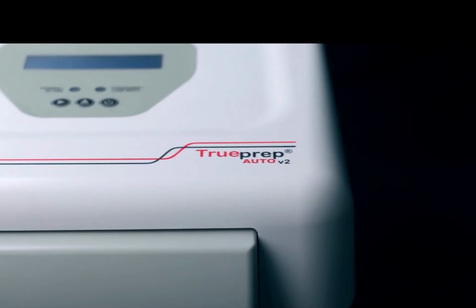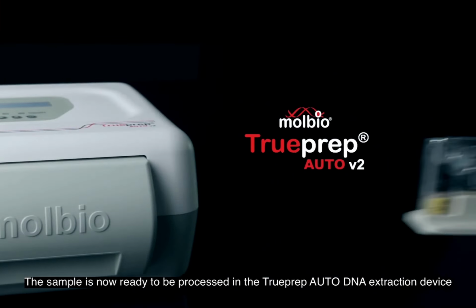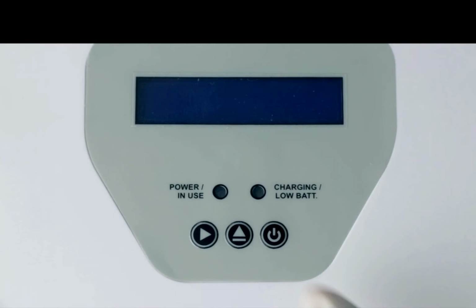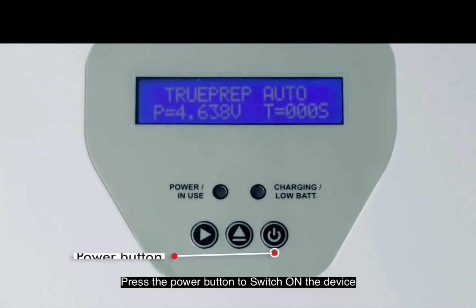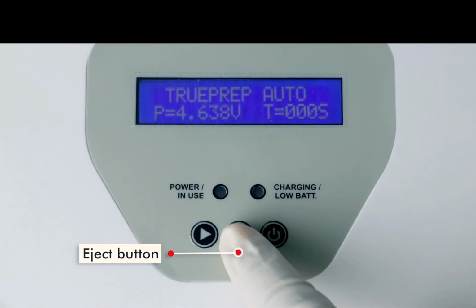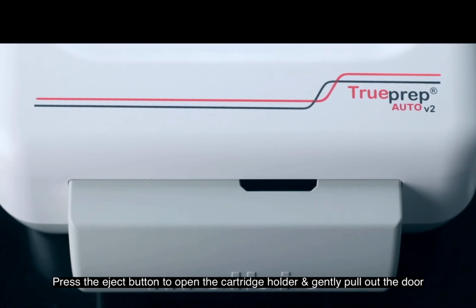Now a DNA extraction machine, you can see. Now it is ready. Now your cartridge is ready. So preferably it is charged. So you can see the buffer count and all. So switch it on and press the eject button in the middle. Okay, press the eject button. So it will slightly open. Okay, then you have to slowly pull little further.